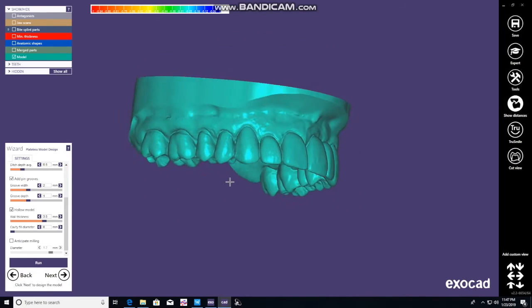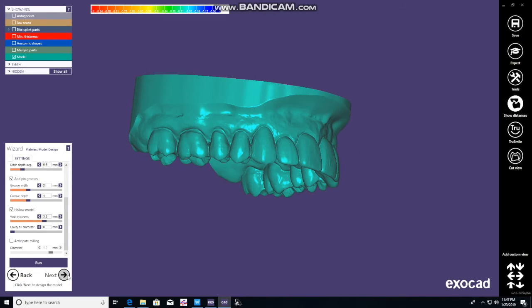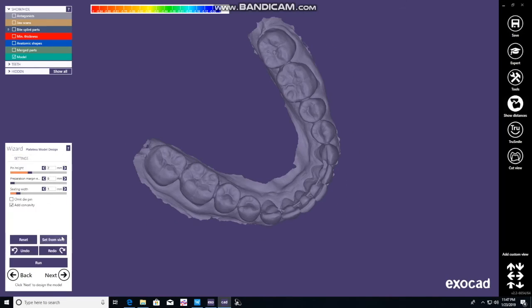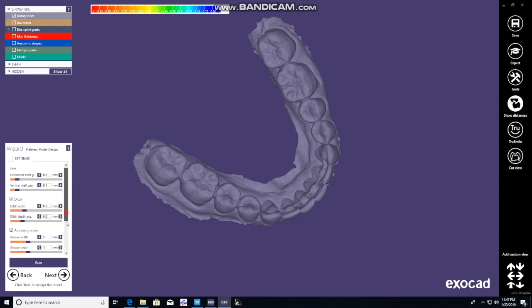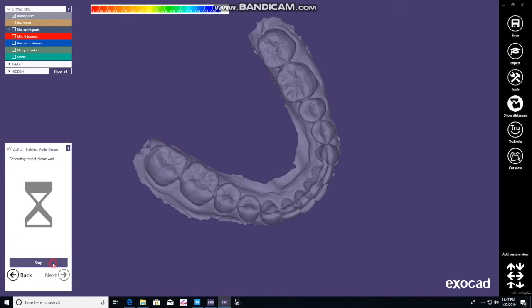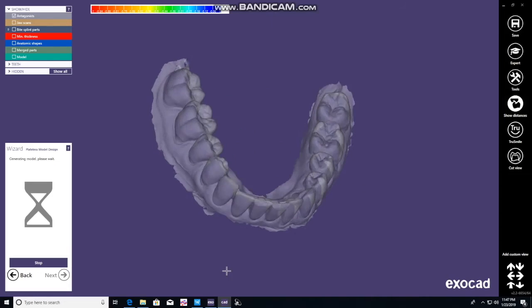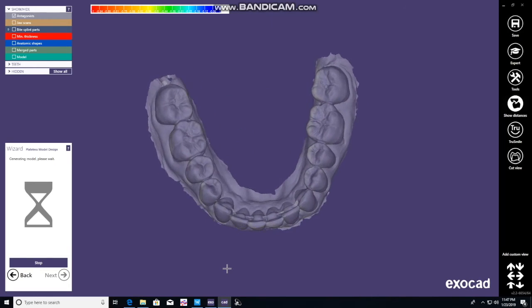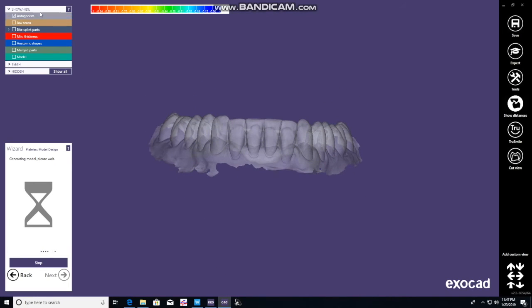I'm just used to keeping the palate just in case I need it for something else down the road. There's your model — click next. Do the same thing with the mandibular model. Scroll down to hollow model, go to 3.5, and push run. You should see it goes much quicker.